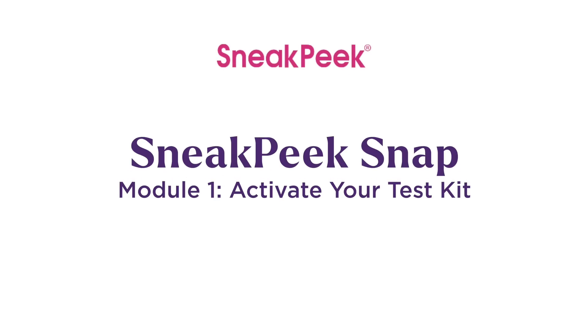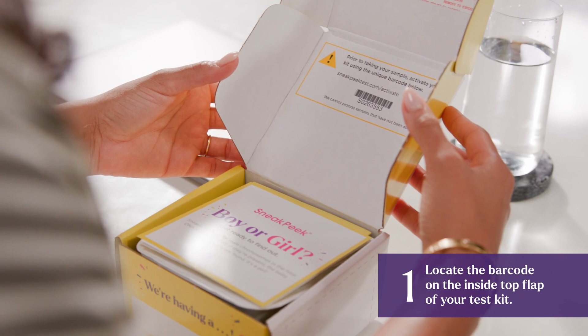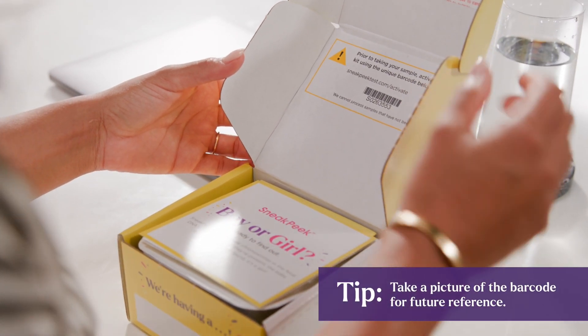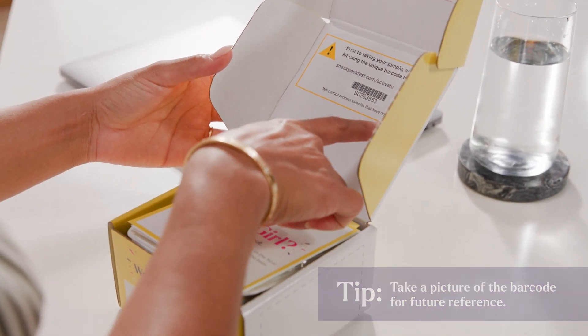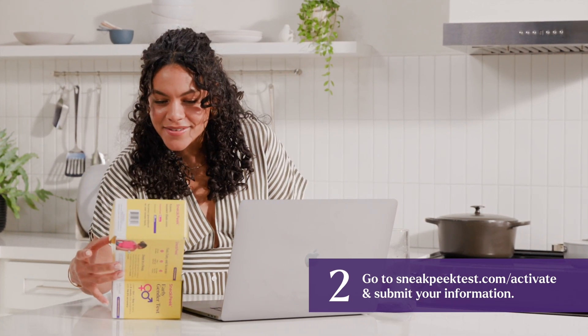First, activate your test kit. We can't process Sneak Peek samples that aren't activated. Locate the barcode on the inside top flap of your test kit. Then go to sneakpeektest.com/activate and submit your information.